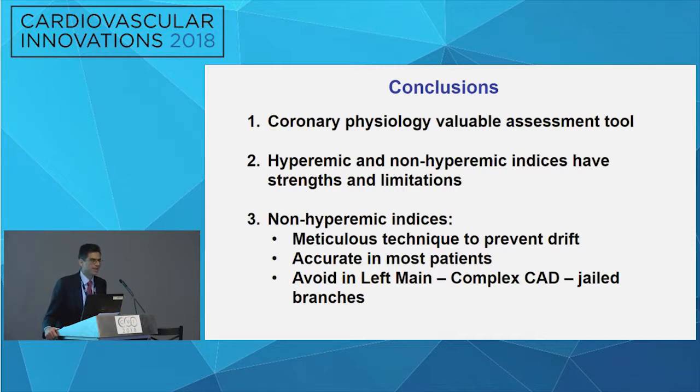How much is that in the capital? Well, I'm with you. But if you have access to that in your lab, it's great. In most labs I've seen a lot of resistance because of the cost. The pharmacy doesn't think about the cath lab cost because their budget is on the drugs. And unfortunately that's the silos we have, where some of the departments don't necessarily talk to each other.